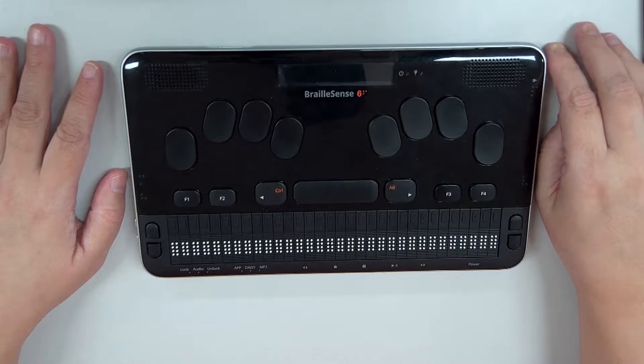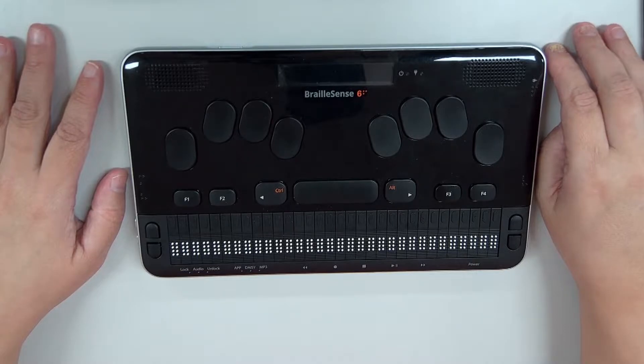If you look at the top face, it looks very BrailleSense-ish: we have a set of stereo speakers, one on each side of the top, and an LCD in the center. At the bottom of the top face is a 32-cell Braille display with 32 cursor routers. The keyboard now has a matte finish and a much lighter touch. It is an enhanced typing experience. We've also changed the shape of the CTRL, ALT, and function keys to give them a more premium look and feel.